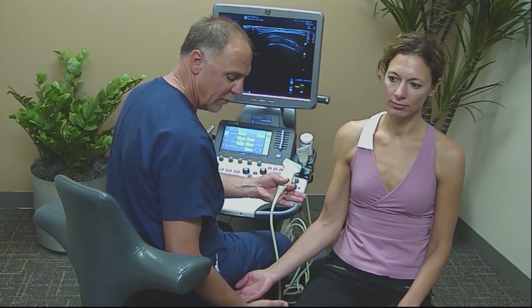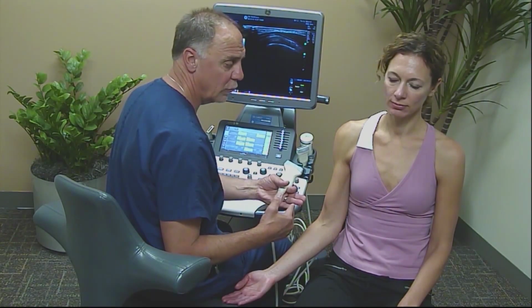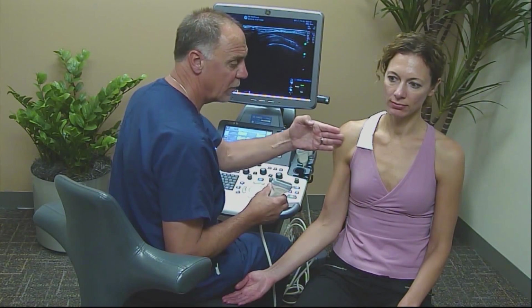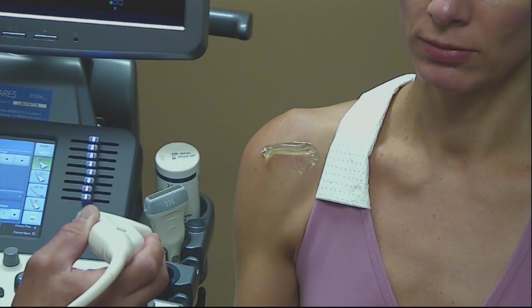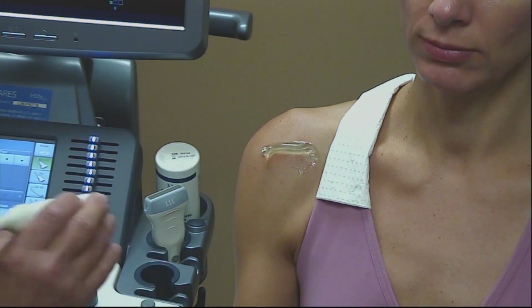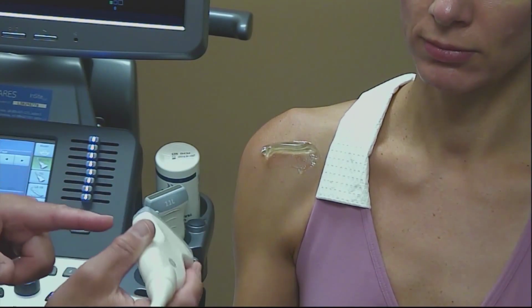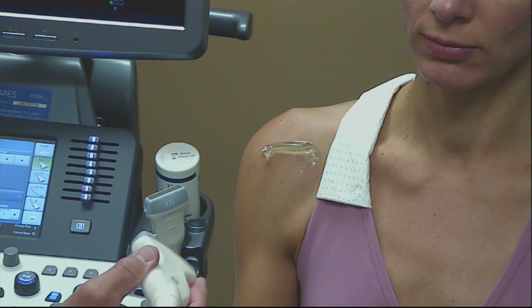And it's nice to have something for the patient to rest their hand on, because this can be a hard position to hold into, which will bring the subscapularis out for our evaluation. Now we'll start our sonographic evaluation of the subscapularis tendon. So I'm going to place my transducer with the orientation marker pointed to the patient's anatomic right.